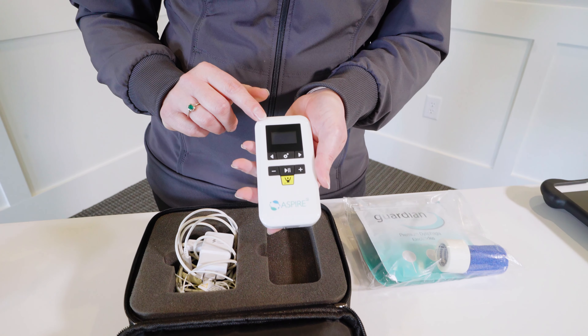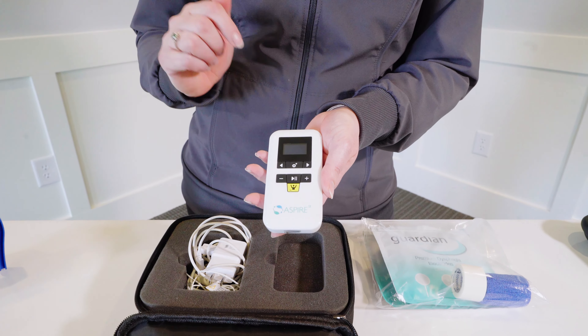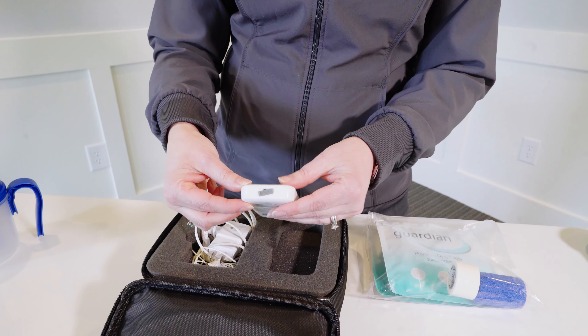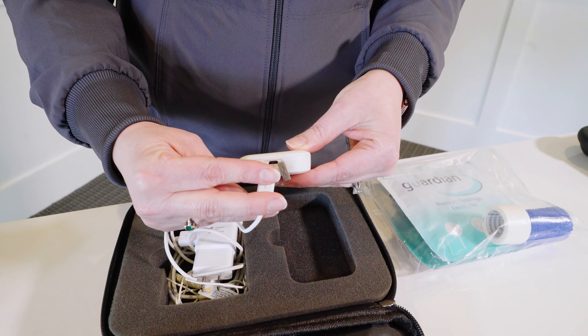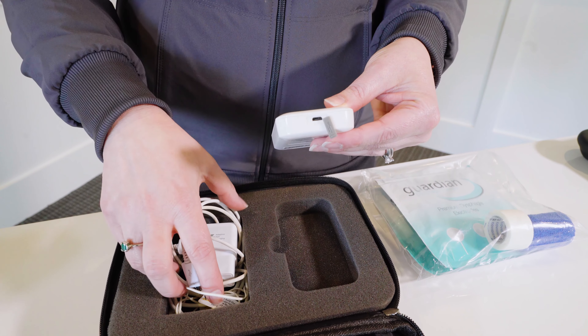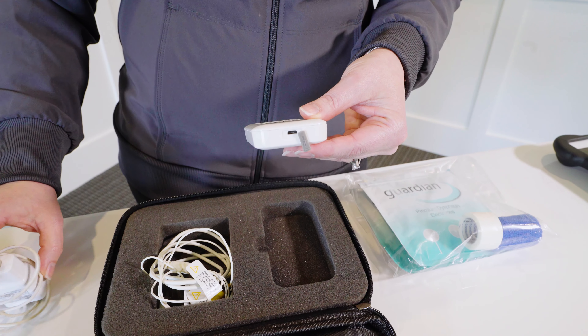When you unbox your Aspire 2, it does come with some battery life, but we want to make sure you go ahead and get that charged. You'll remove the rubber on the bottom and the charger just plugs in right here. Note that you won't be able to use the device while it's charging, so make sure you plan ahead.